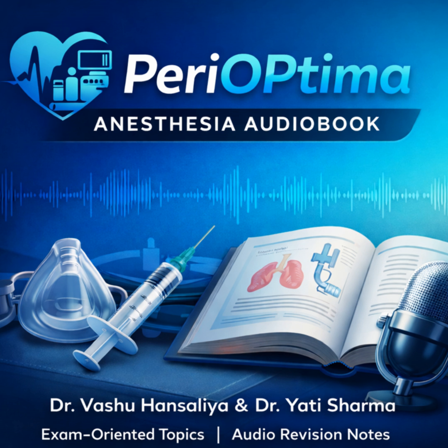Now, here's the classic Viva trap. How does the ventilator know when to stop the breath in PSV? It's not set by time, and it's not set by volume. This question separates the students who really get it from those who just memorize names. PSV is flow cycled. Flow cycled, explain that. The ventilator is constantly monitoring the rate of airflow going into the patient. As the lungs fill up, that flow naturally slows down. When the inspiratory flow drops to a certain percentage of its peak, the default is usually 25%, the machine says, okay, inspiration is done, and it cycles off, allowing exhalation. Flow cycling at 25%. Got it.